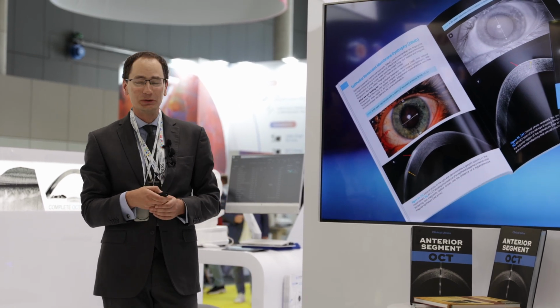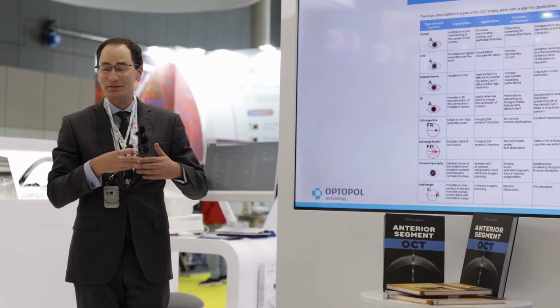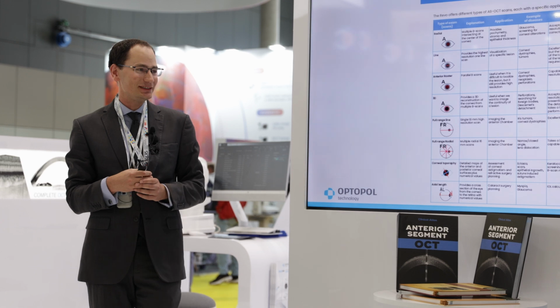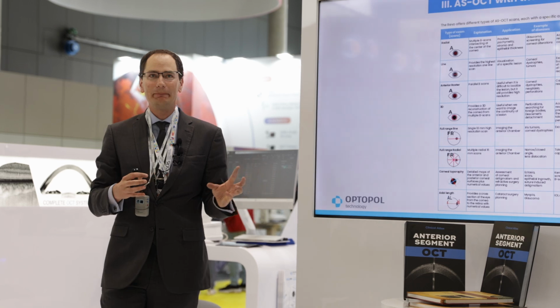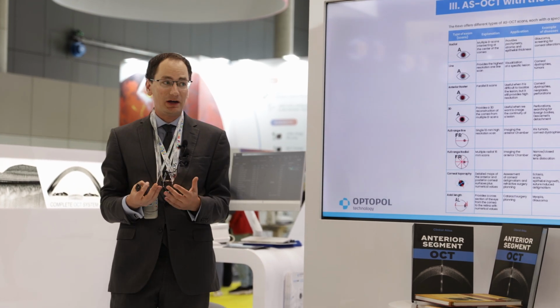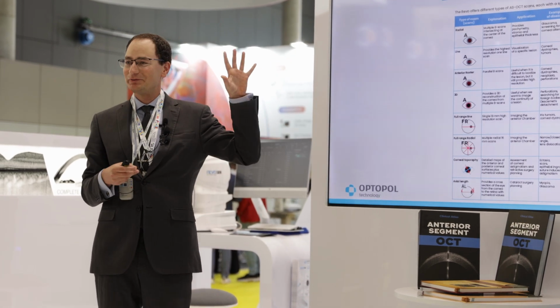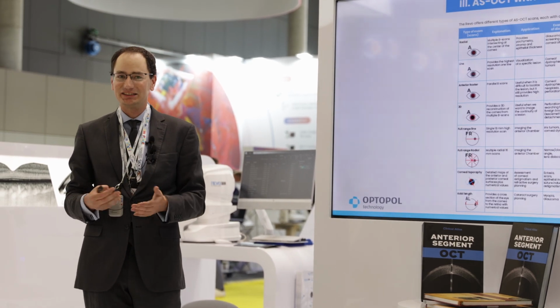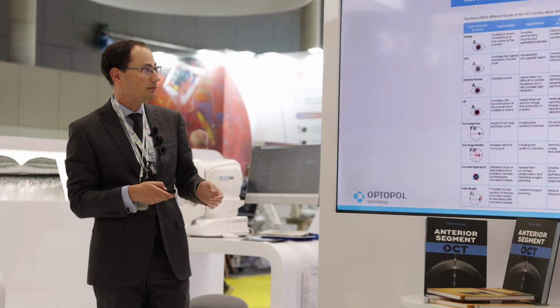And right now we are going to present the anterior segment OCT. So the thing that I really didn't like about this previous book is that it didn't have this application reality. It had a theoretical knowledge of the diseases, but it was very hard to apply this. So I started this time from just a very simple graph, very simple table, showing you what kind of scans for what kind of indication you should use based on the applicability of these scans on the machine.